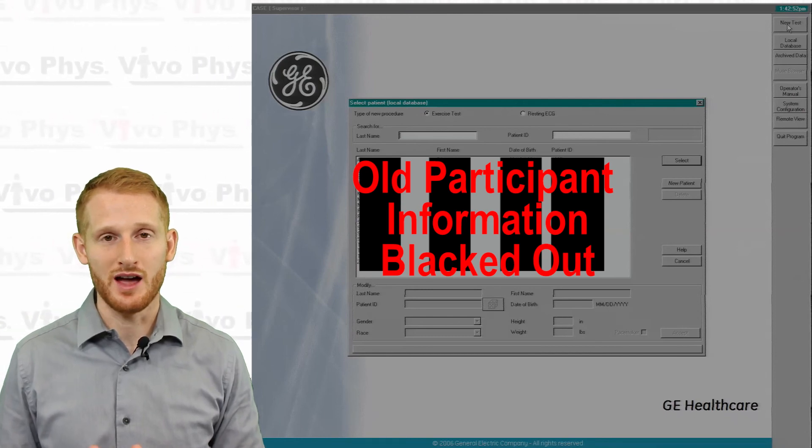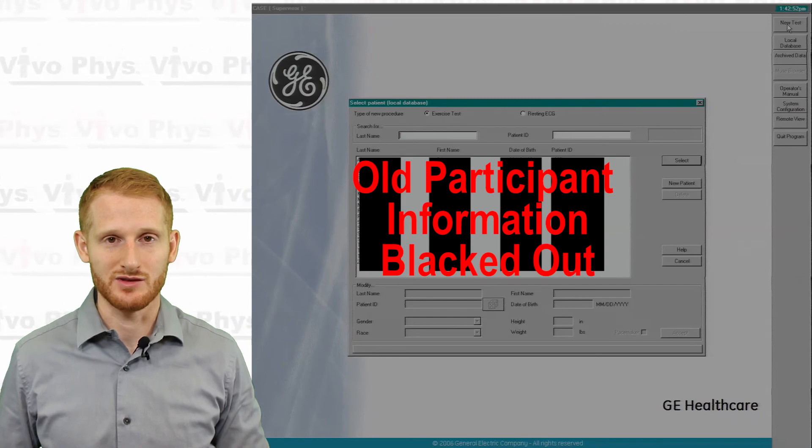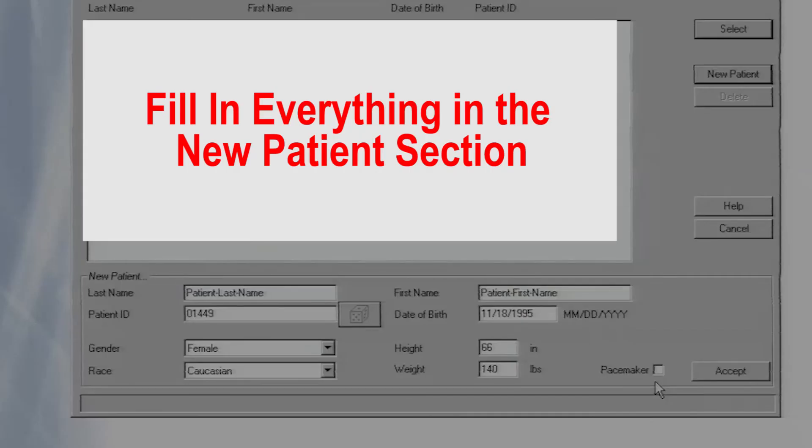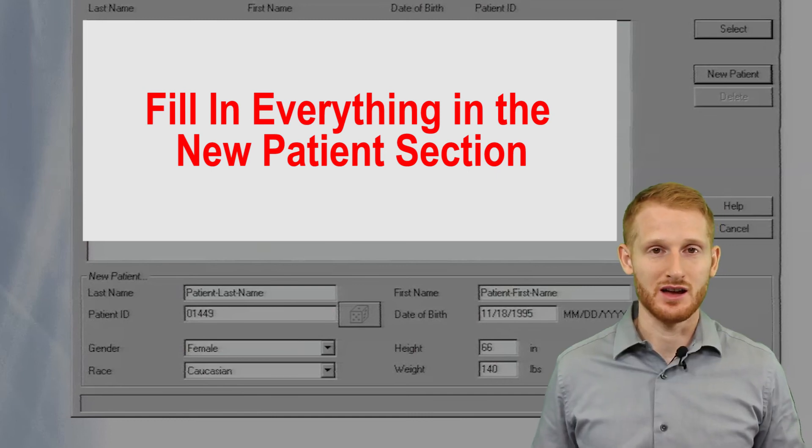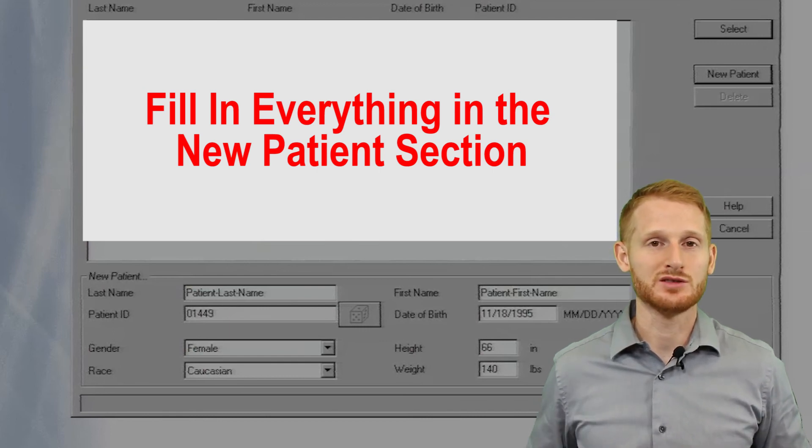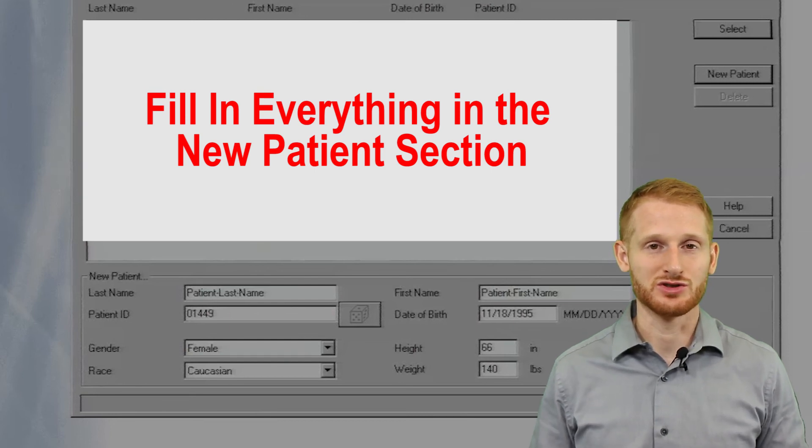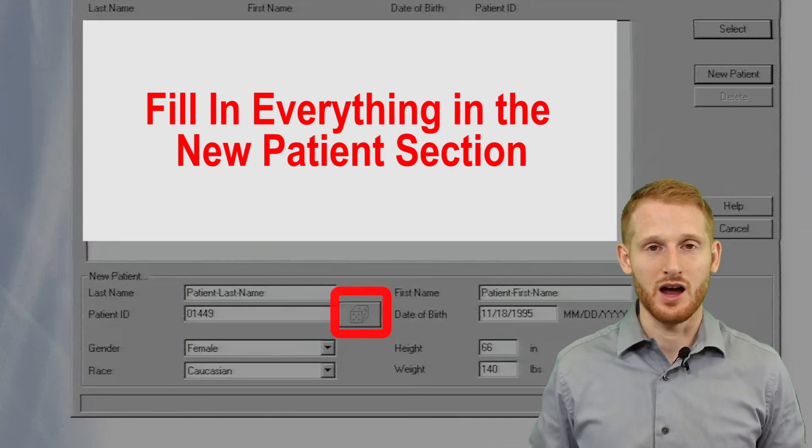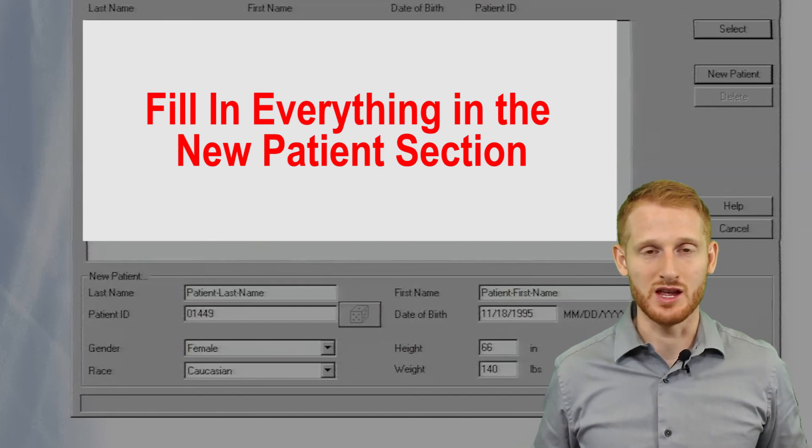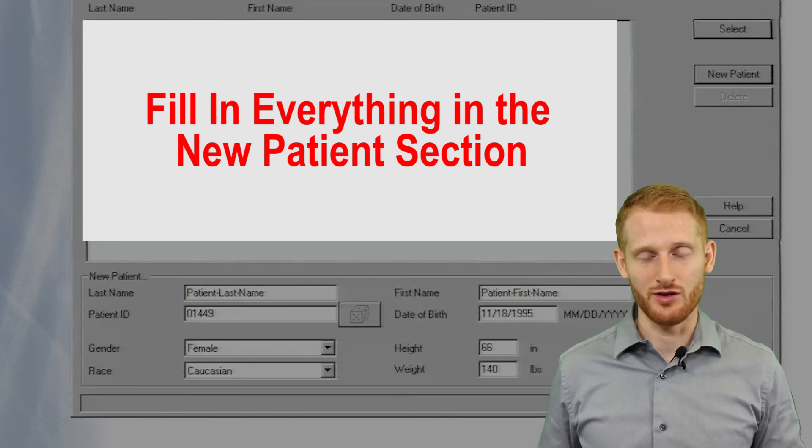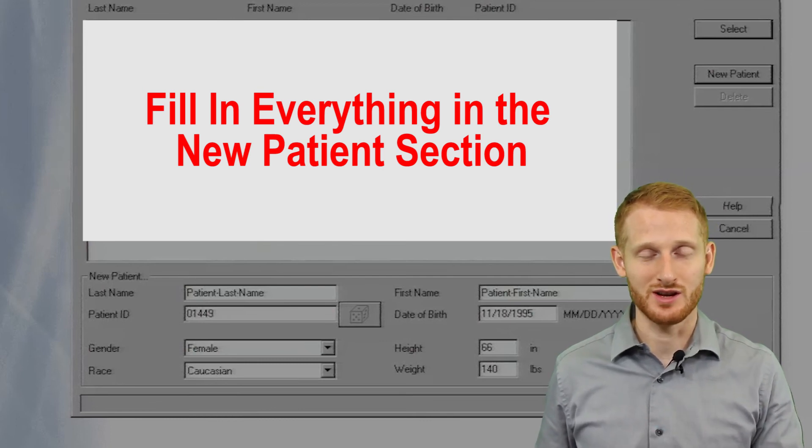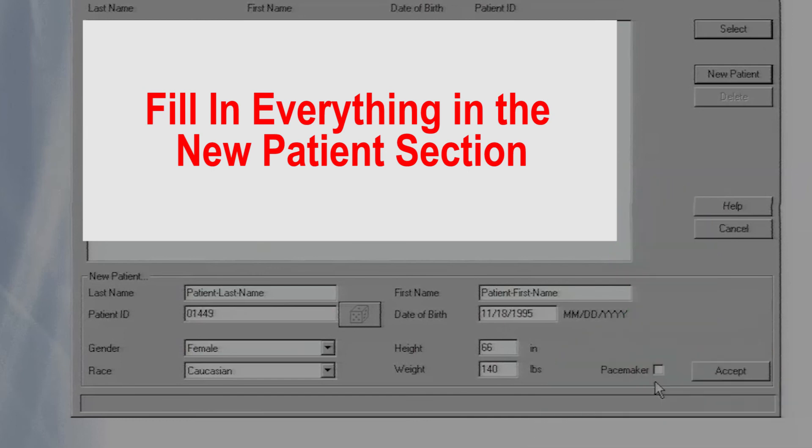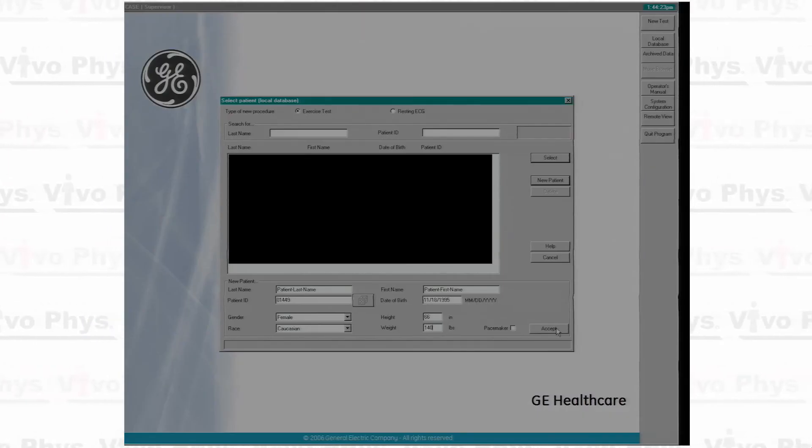If they are somebody that you have not tested before, you need to create a new participant. Once you click on the button that says new patient, you're going to want to type in the person's first and last name. If this is for research, make sure that you put in just their subject ID number and not their actual name. There is also a section where it asks for a patient ID. You do need to put in some sort of ID number. If it's a research subject, you're just going to put their research ID number in again. If it is not, there's a little dice button there. You can just click that, and it'll generate some random number. You also should put in their age, because that's going to be used to predict their age-predicted max heart rate.